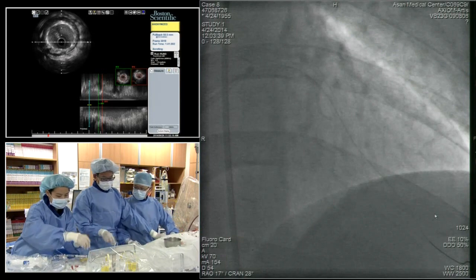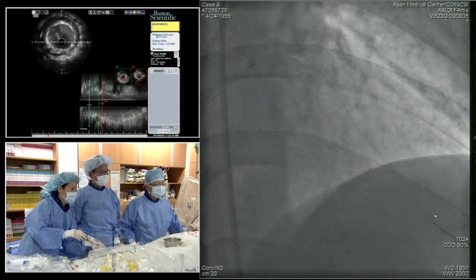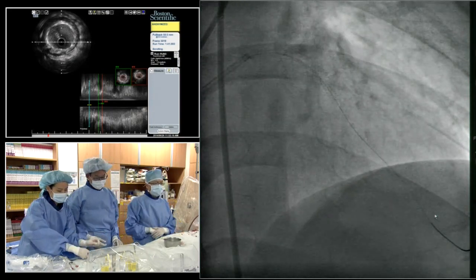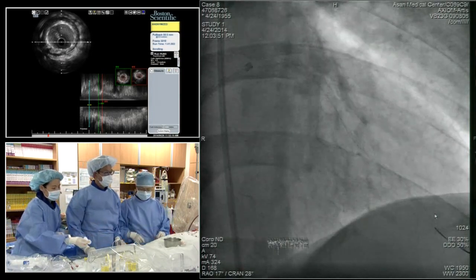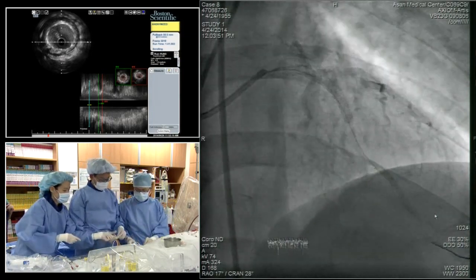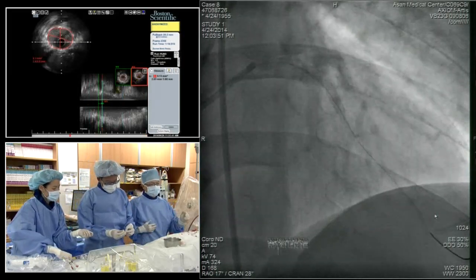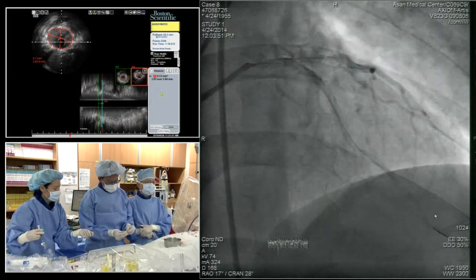We'll do an angio real quick. Make sure everything's okay. Ready? So the final ultrasound, you're looking for what? Just bigger area? Yeah, the proximal LAD ostium was a little small to me, and so I just want to make sure that it's expanded well. And that's really the only area; even the proximal left main edge, I thought was okay. Yes, that's why I was wondering whether you could skip that.